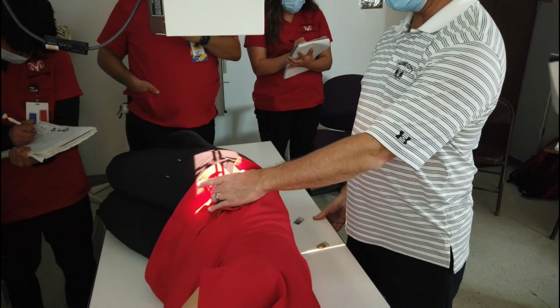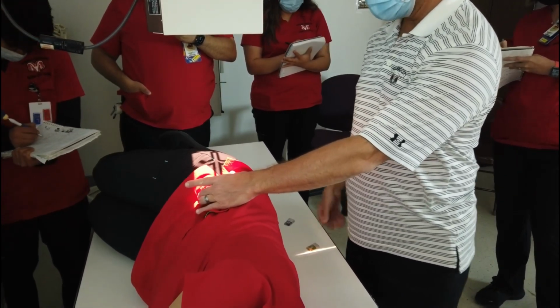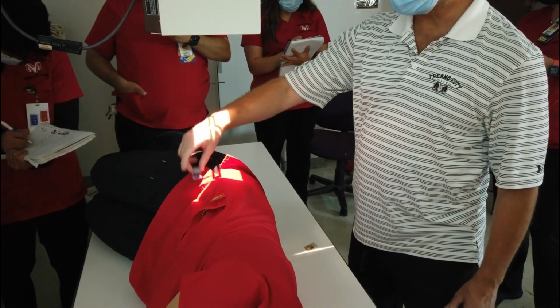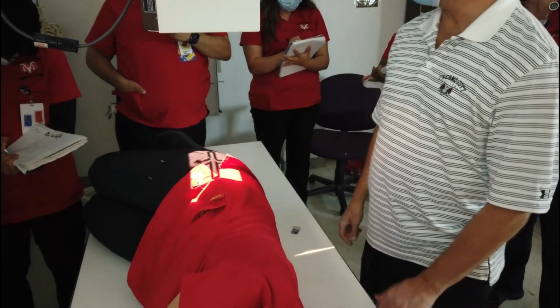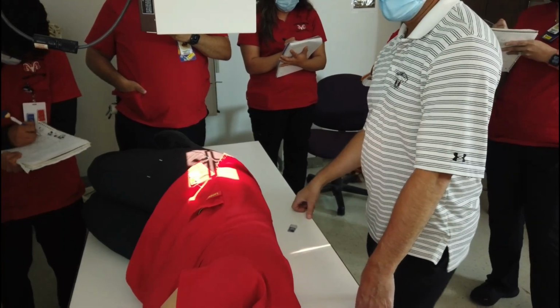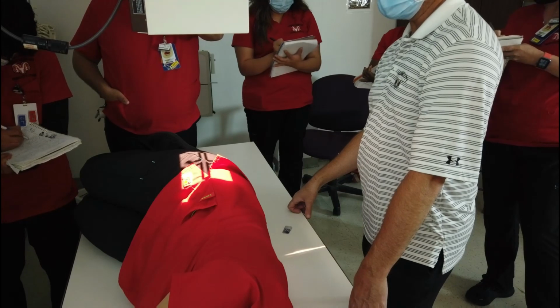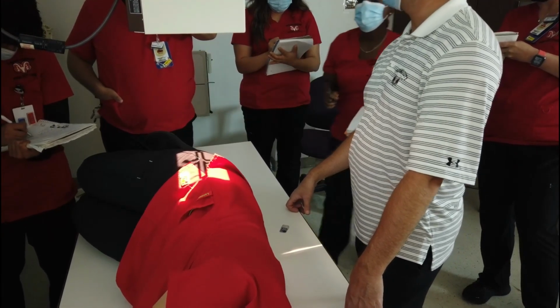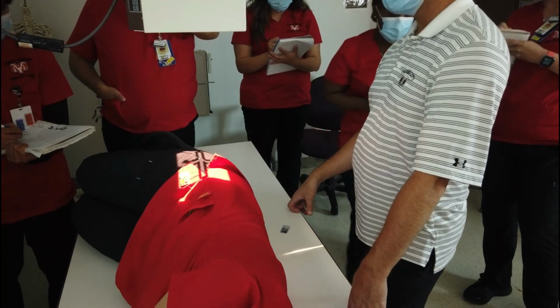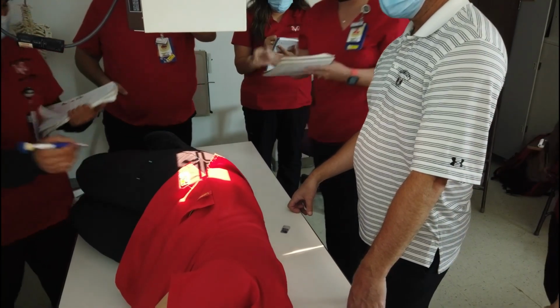Go down 1.5 inches to 2 inches. Center midline. Mark it. Center, left marker up high on the left anterior side. You said 1.5 to 2 inches below the ASIS and mid-coronal plane, and markers up and away.